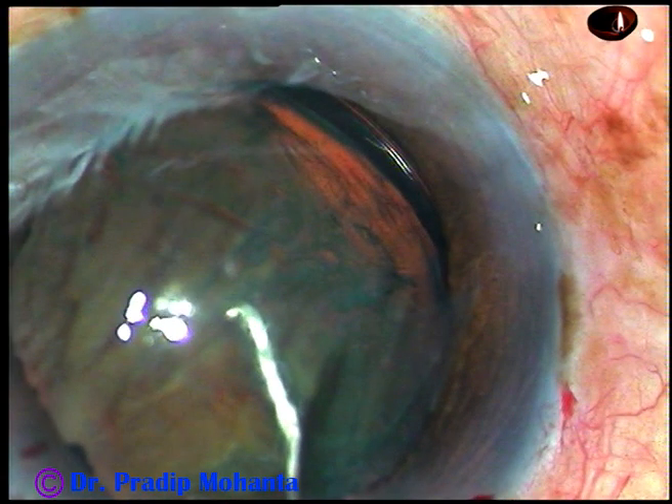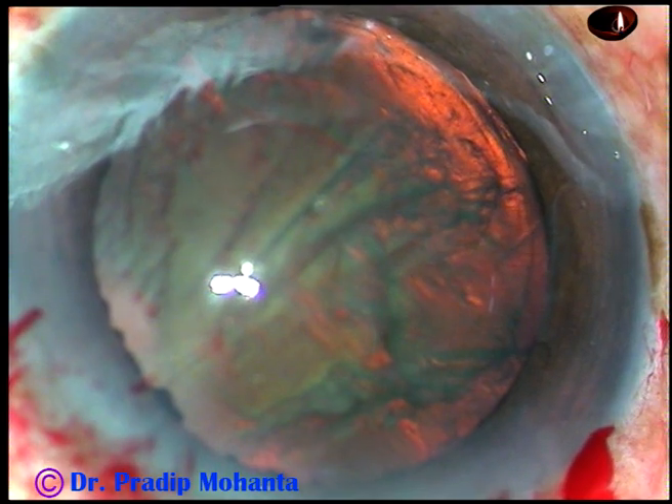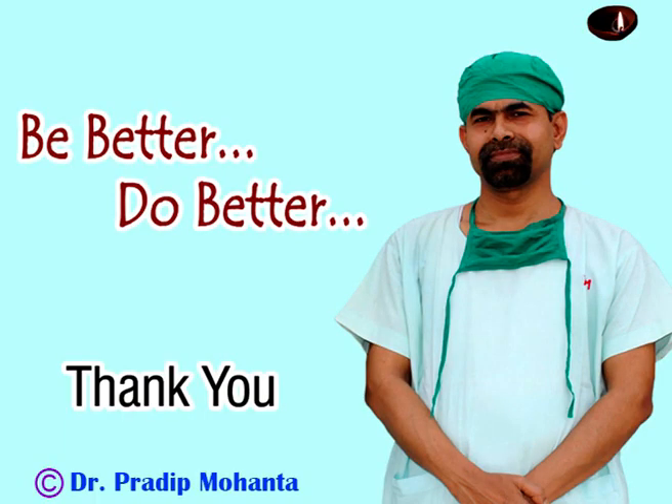In this view, we can see the CTR at the equatorial region of the capsular bag. Thank you very much for your attention. I hope this video has given you important tips to place a CTR in the capsular bag.